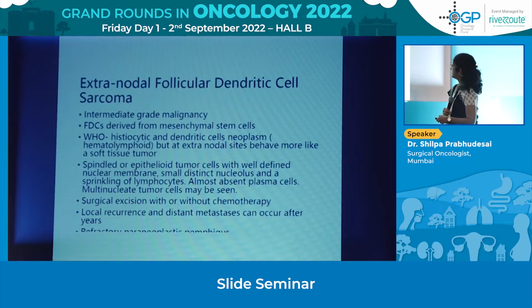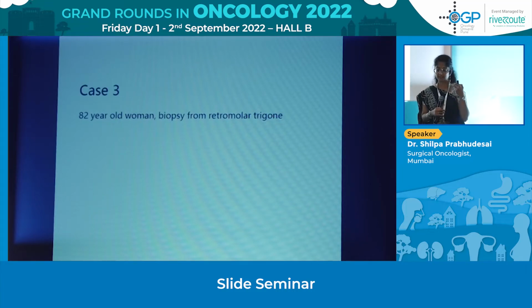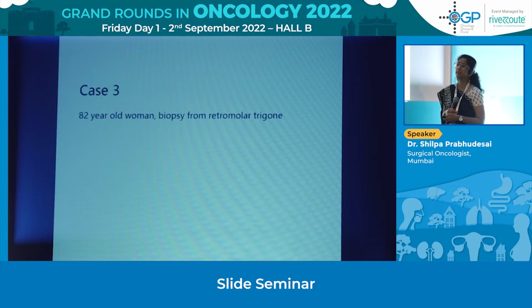The third case was a biopsy from an 82-year-old woman. She presented with some kind of discomfort in her retromolar area, which was biopsied, and we received biopsy tissue.